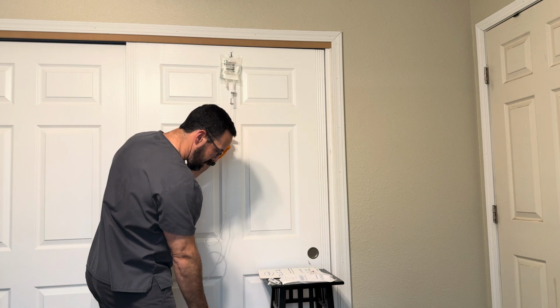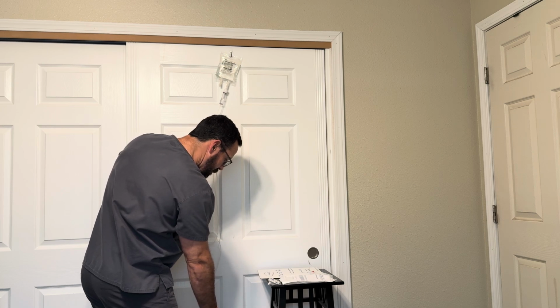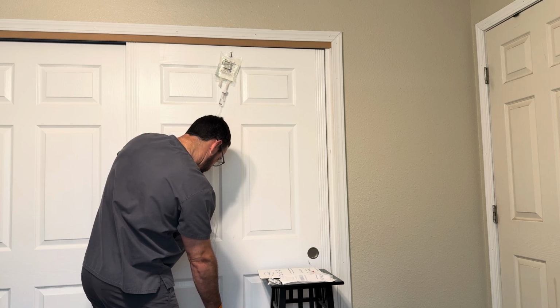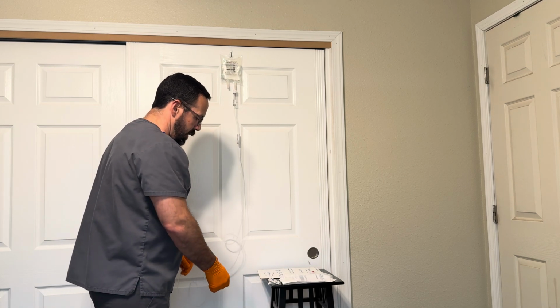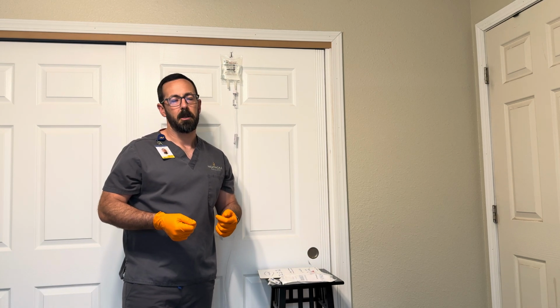Do it one more time. A little bit of air in there still. All right, we're good now. So now I need to calculate my drop rate once I've connected to the patient's IV.